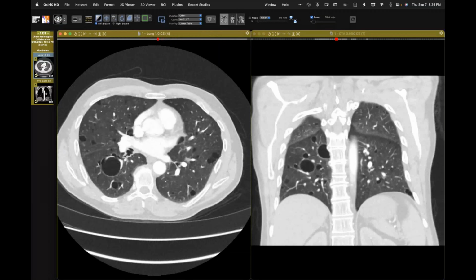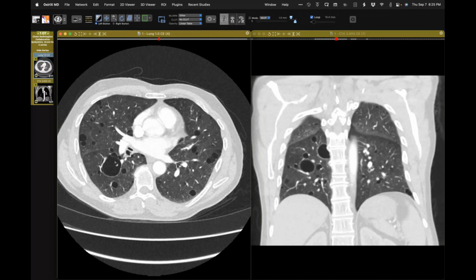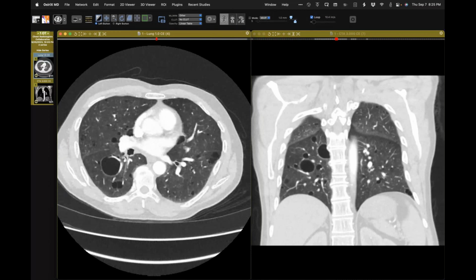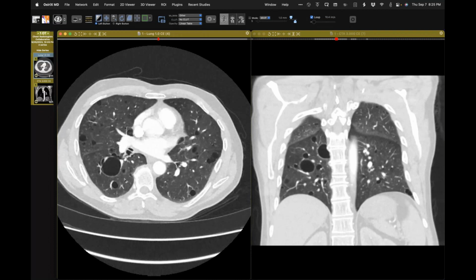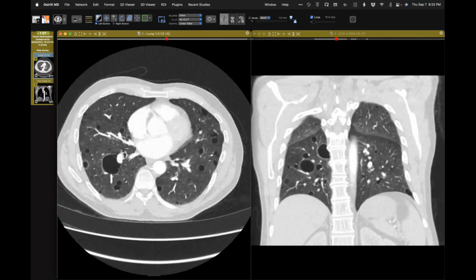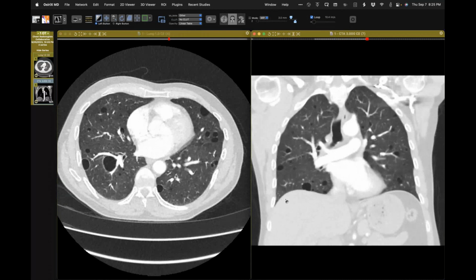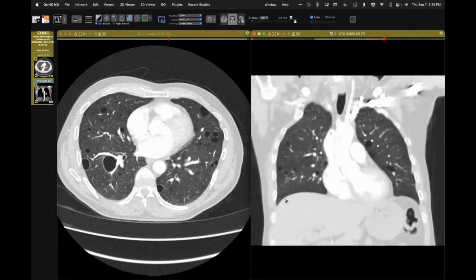Do you find the notion of the vessels traversing the periphery of cysts, or right through the middle of septated, complicated cysts like that, helpful? Because I do in terms of a differential. Absolutely. I can see that in quite a few patients; again, I see that with Sjogren's syndrome and autoimmune disease.